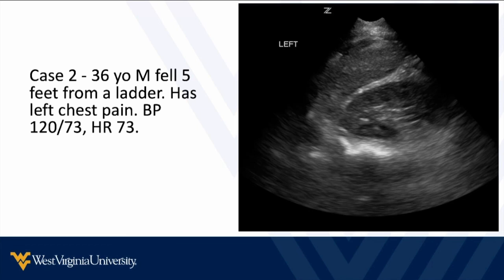But instead, if you recognize even these subtle findings of fluid and some abnormalities in their abdomen, okay, this patient needs the nurse to be with them. They need that second IV. They need the blood to be with them in the room or as they go to CAT scan. They need to get CAT scan ahead of the other patients with the minor injuries or whatever. This information helps you make decisions that help you manage the workflow, manage the patients, and manage your entire department.